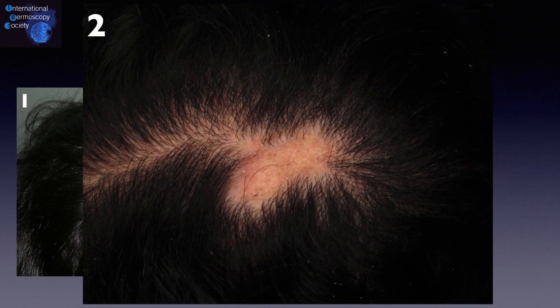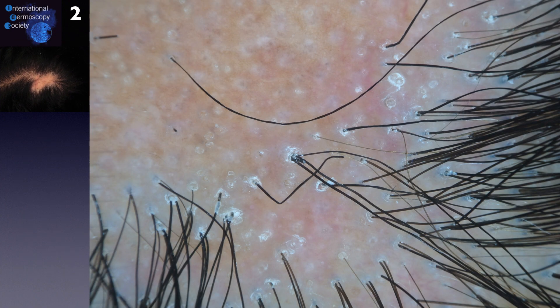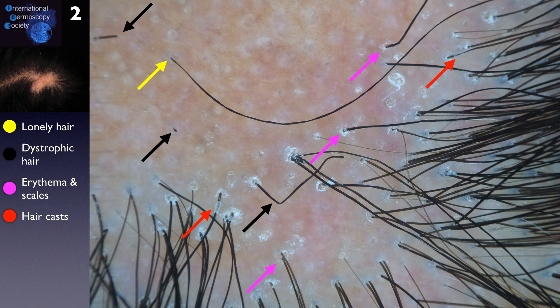Now the second case shows discreet erythema, scaling, and a lonely terminal hair in the center of the patch. Again, dry tricoscopy is important: the lonely terminal hair is in fact a polytrichia due to intense inflammation around it. It is possible to see other dystrophic hairs such as broken hairs and black dots. Furthermore, there is intense peripheral erythema and scales forming hair casts in some areas, and an almost complete absence of vellus hairs with normal scalp skin in the center. Large white areas representing follicle scars and pinpoint white dots are also seen.